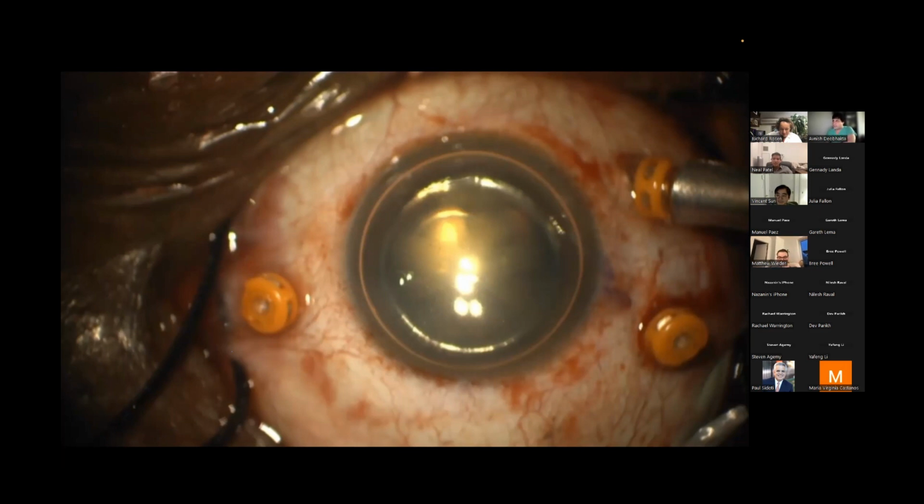It doesn't feel like it's unstable. So the key here is to determine whether it's unstable. If there's zonular dehiscence and phacodonesis going on, then perhaps you might consider it. But all of the things you just named were going to be true when you put oil in the eye.